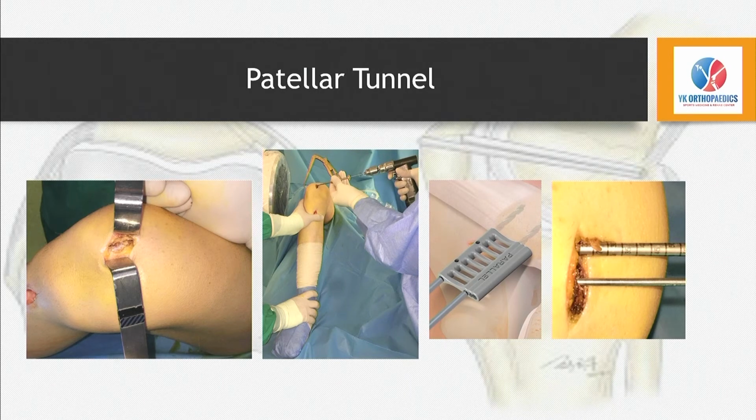There are now different drill guides and pins available you can use. If there is none, you always have an ACL drill guide, which sometimes I use, so you can put your ACL guide and stabilize your patella against it, and you need to pin 2 pins. Those 2 pins should be 15 millimeter apart, okay? So there are guides available that help you place 2 parallel pins 15 millimeter apart. If you're doing it freehand, make sure it is 15 millimeter apart.